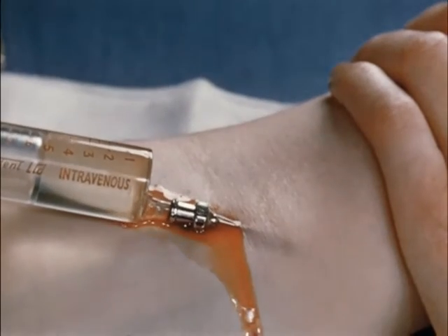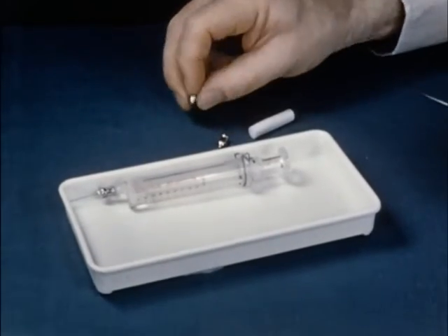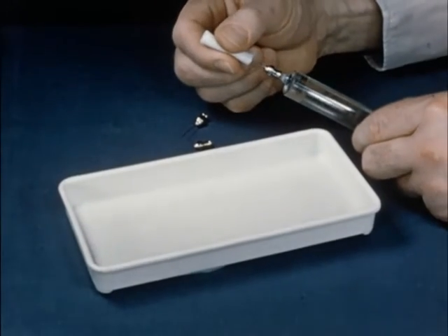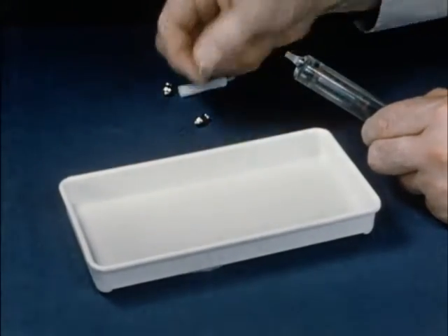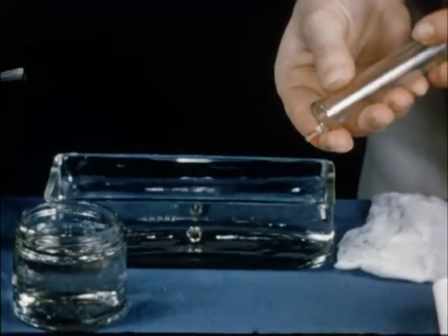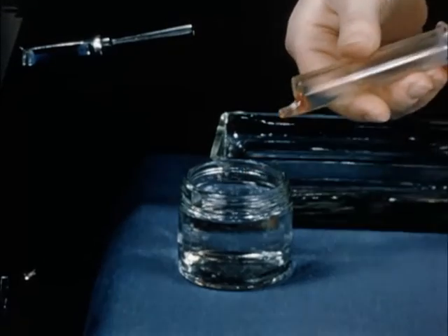This will never happen if the needle is firmly fixed. Do handle the delicate needle points with care. After such treatment, only the hub is of use — when sealed, it will make a nozzle cap. Needles are kept in sterile cotton rolls to protect the points and to disclose any snags when the needle is removed. The solution is heated to blood temperature before use, and for this heating a nozzle cap replaces the needle. Careless handling when cleaning is also a major cause of damaged needles. After use, first the syringe is flushed out with water, then the needles — in practice this is usually done under running water.